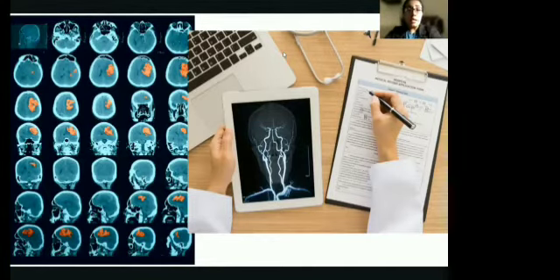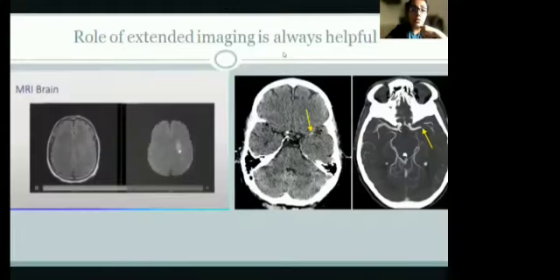If you have the right tools, then life really becomes easy. And in terms of radiology, this is the protocol we follow in the hospital in UAE. We do a CT angiogram along with MRI, just quick diffusion and FLAIR images for our patients who are having acute stroke. Even if we are not able to do MRI, for sure we do a plain CT followed by CT angiogram. And if thrombolysis is required, we often thrombolyze in the CT suite itself. So we save time, but at the same time, we know where exactly the thrombus is lying as well.